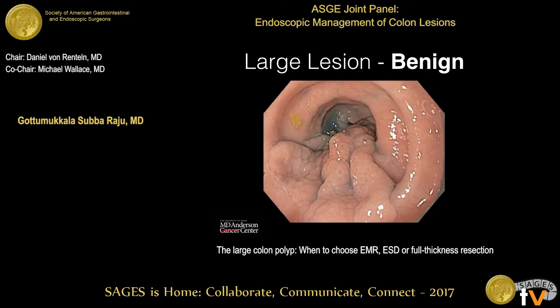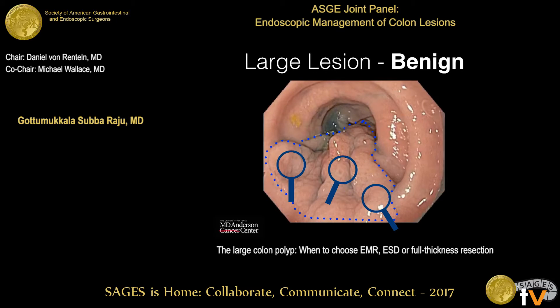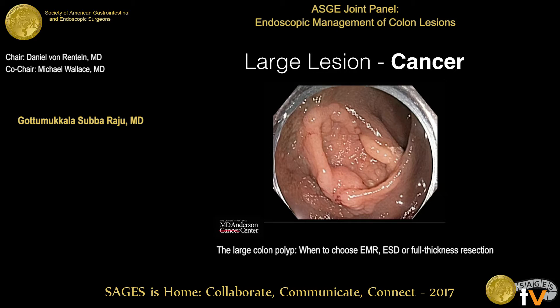Here is a large lesion — as you scan the surface, you can say this is a benign lesion, so you could go ahead with resection. Here is another lesion referred as a benign tubular adenoma on biopsy, but the biopsy was not done at the right place. Whenever you see a lesion that has a flat area or a bald area, that's where you should focus your biopsy — that's where you will find cancer. In this lesion, the abnormal area came back as cancer, and these are lesions you should avoid resecting.